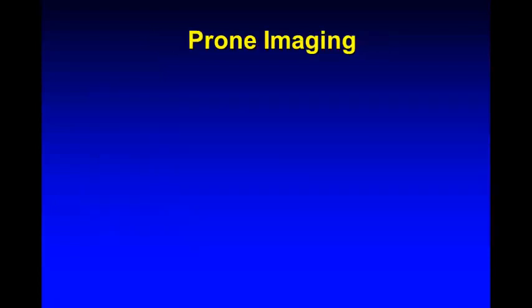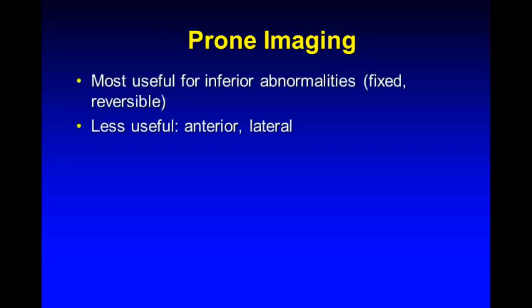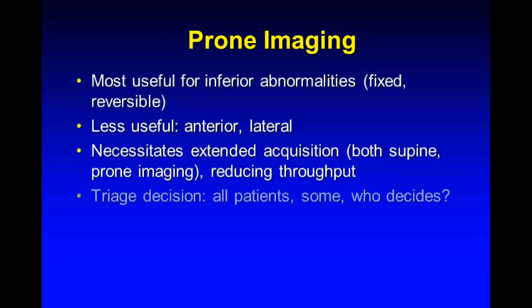Now, some people can say I can do prone imaging. Prone imaging is an excellent tool. The problem is it induces an anterior defect in some patients.